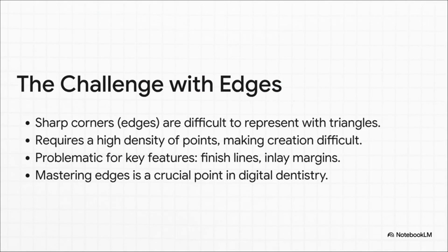And here's where that becomes a huge problem in dentistry. The most critical parts of any restoration are the edges, the finish lines, the margins of an inlay. They have to be incredibly precise. With a mesh made of triangles, defining these sharp features accurately needs a crazy high density of points, which makes them really hard to create and even harder to edit later. Mastering these edges has been a major hurdle for a long time.